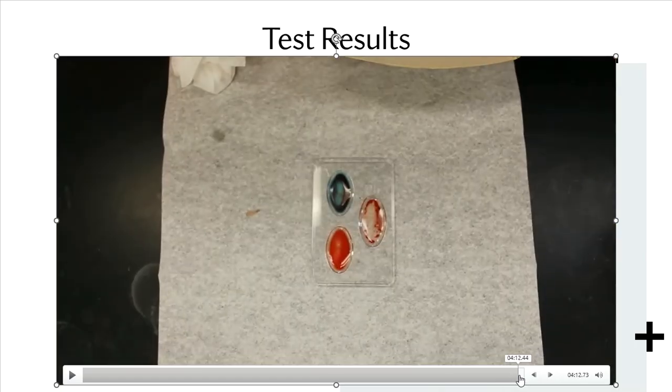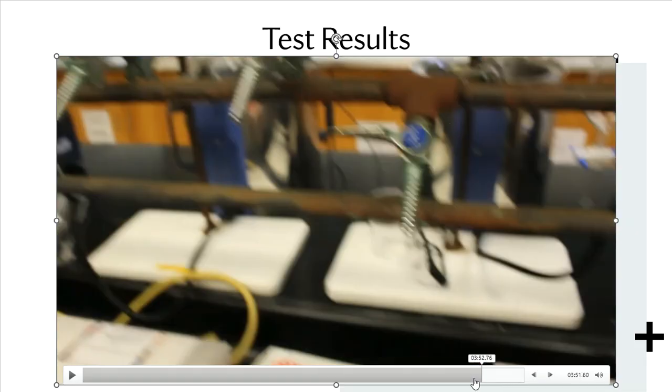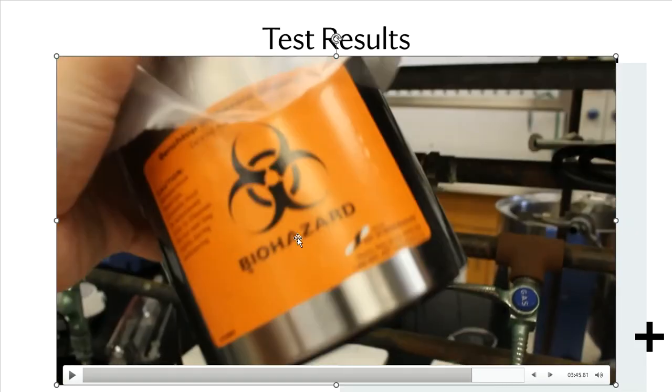We don't know what kind of nasties you're carrying. We don't know what's inside your body. And we just want to be safe and we want to be protective of that whole thing, both us and our custodial staff and you. So for that reason, throw them away in the biohazard trash can. That is a trash can that will be labeled with the big biohazard sticker that you'll see here. Very easy to identify, not a problem at all.